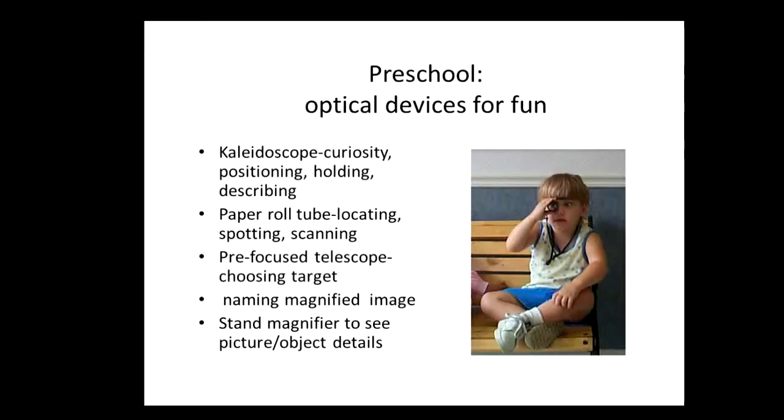Optical device training can be done at any age level, but you'll need to adjust your techniques and materials and settings to your student's age and educational level. Starting with young students is recommended to capitalize on the abundant curiosity and to lay down the foundation for learning concepts. For the preschooler, optical devices can be presented in a way that makes them fun.